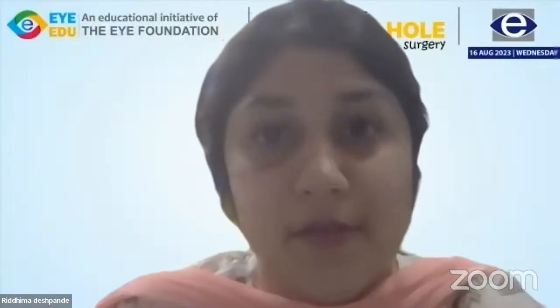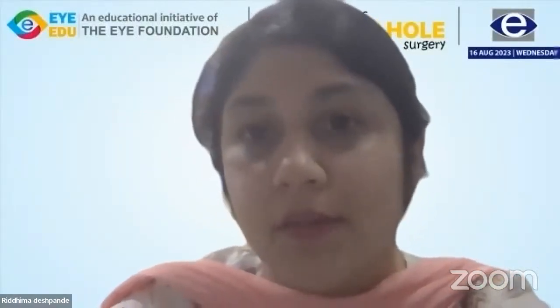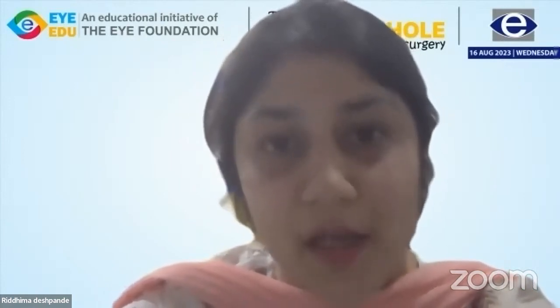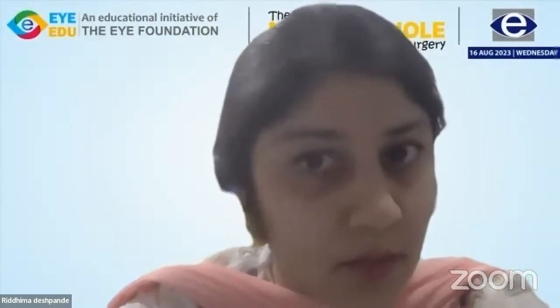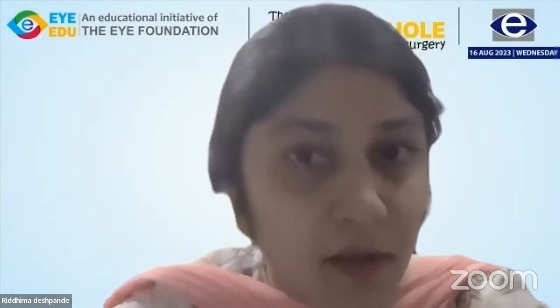So thank you, sir. I have a question for Dr. Dhaivat. The first case that you showed, in the serial OCT, the lamellar hole eventually converted to a more degenerative type. Initially it was a very sharp split, and later on it became more degenerative. Although the visual acuity was okay even at that level, could we have done anything earlier? Does early surgery or early intervention in these patients help, or are they eventually going to progress to degenerative anyway and we leave it alone?